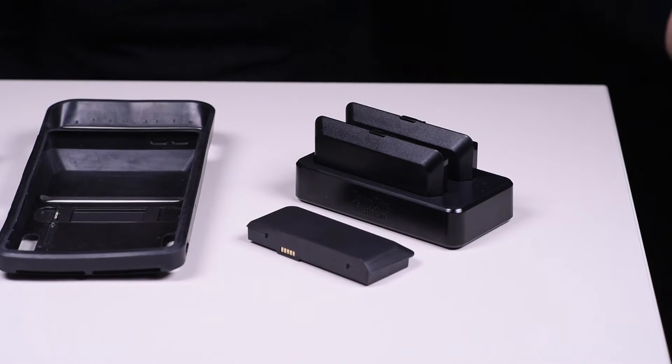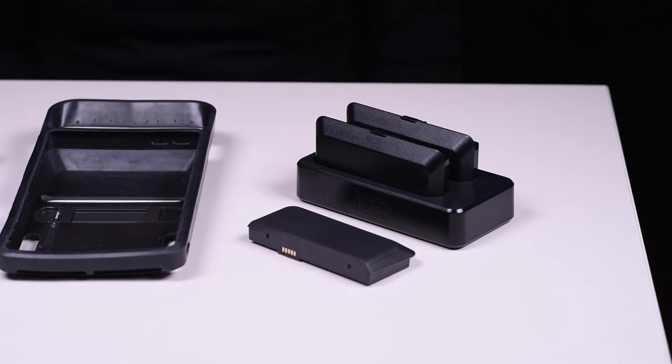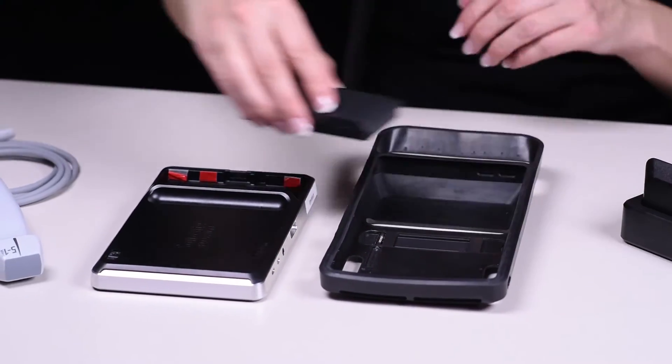iViz comes with three batteries. Before using the system, you must install a charged battery. To do this, simply click the battery into place on the back of the system.